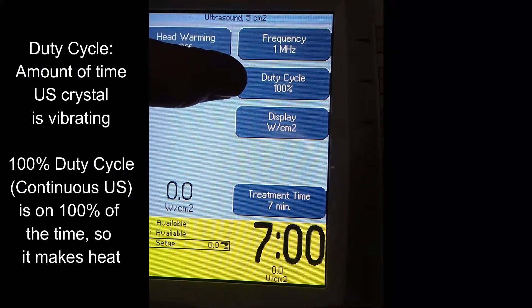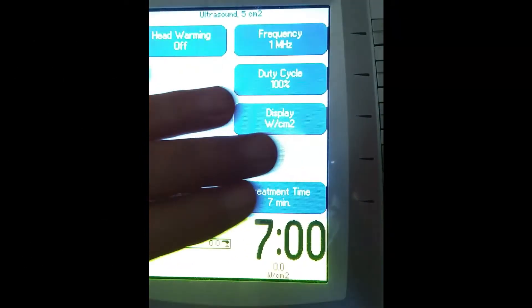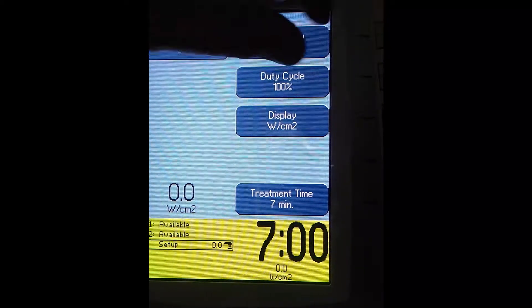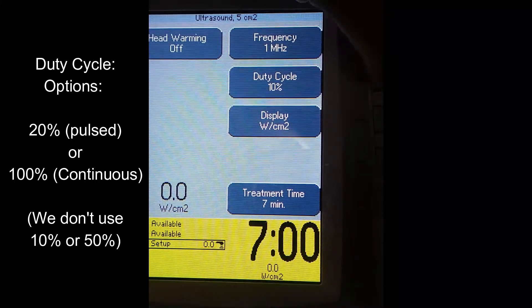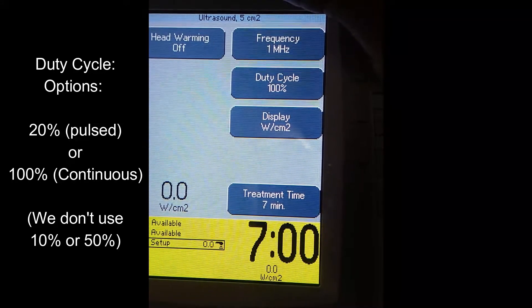The duty cycle is how much the ultrasound head is vibrating. If it's vibrating at 100%, it's essentially causing warmth by being on 100% of the time. The duty cycle we'll use for making heat happen will be 100%, also known as continuous ultrasound. As you toggle through, there will be four choices. The 10% duty cycle we don't tend to use. The 20% duty cycle is the one we'll use for pulsed ultrasound. The next one will be 50%, and then it goes back to 100%.